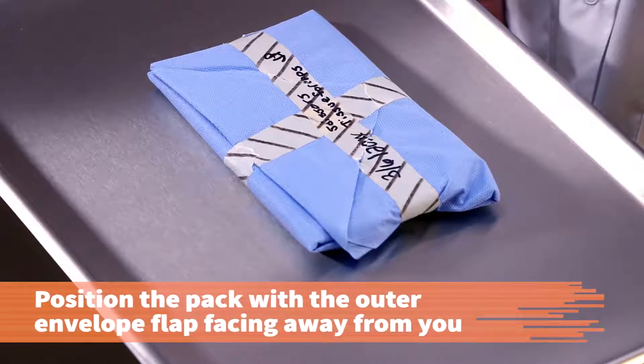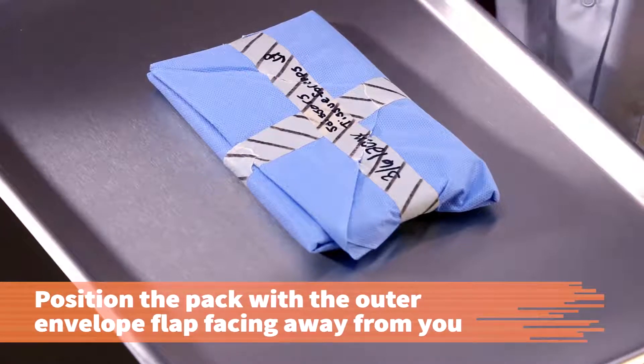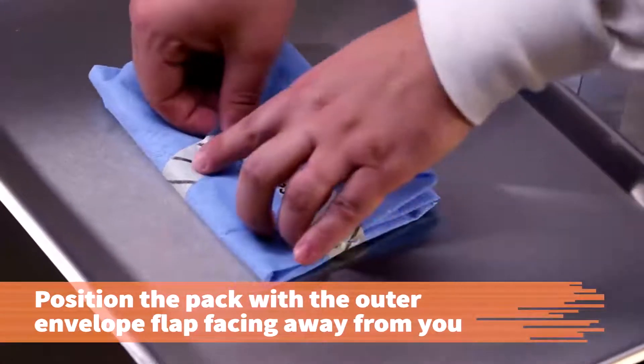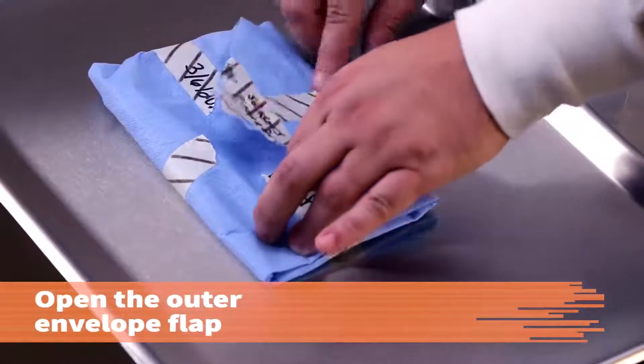Position the package so that the outer envelope flap is facing away from you. This way, you do not have to cross over the package to open it. Open the outermost flap.